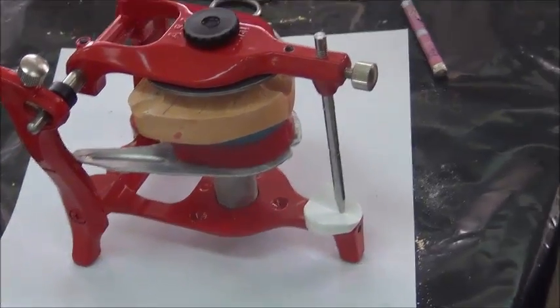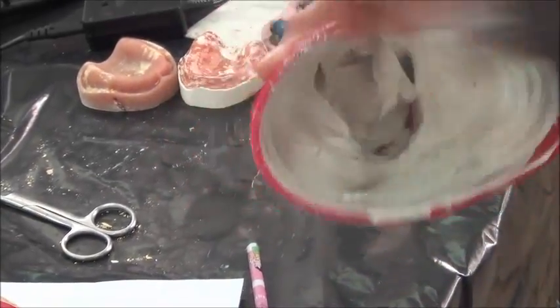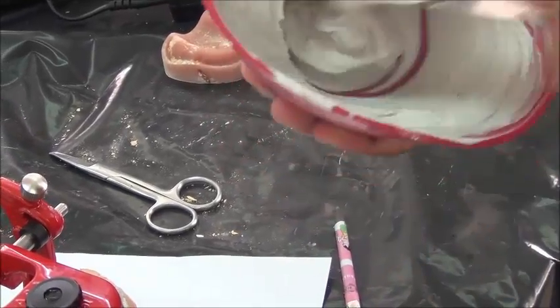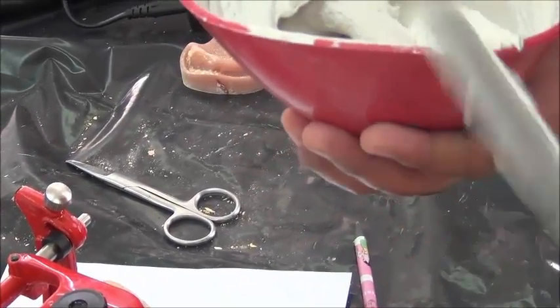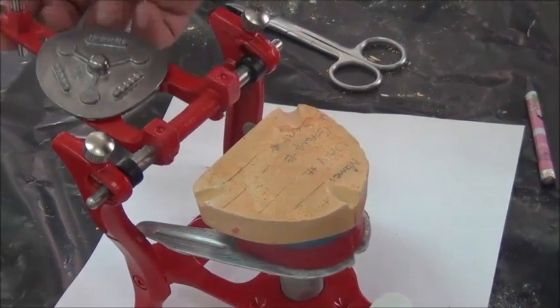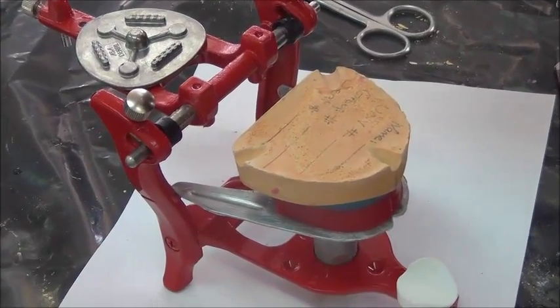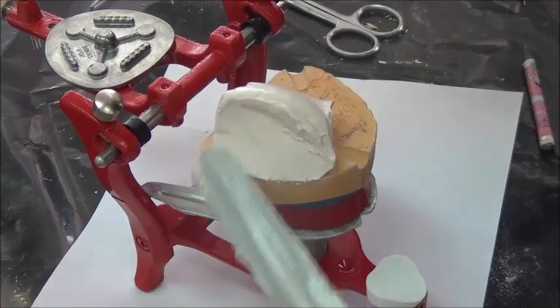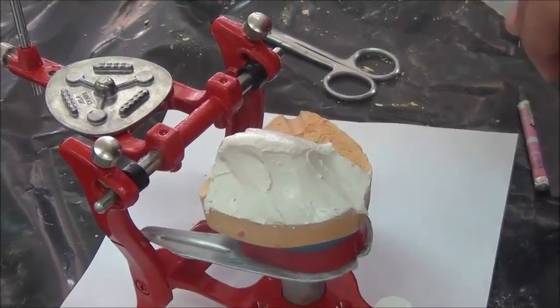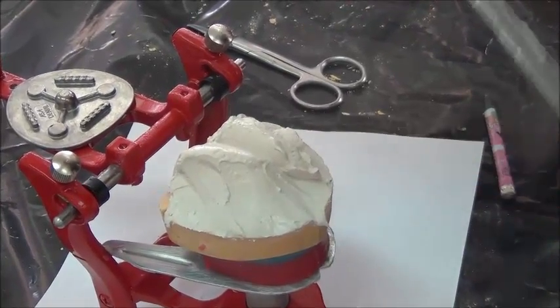Now once everything is ready, we make our mix. It's a mix of plaster, and it's a bit heavier than the mix we have made for the impressions. So once it's smooth, we add it to the cast immediately. So we open the upper member of the articulator. We add it over the cast that has been soaked previously. And this is why we told you please write your names on the back of the cast, because the names that you have written on the base will disappear under the mounting material.